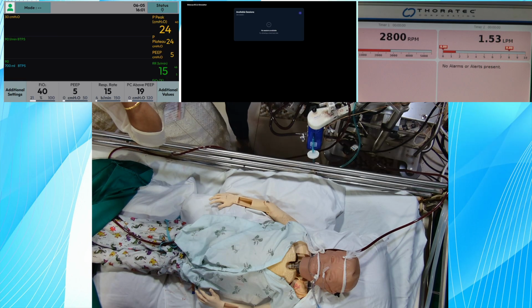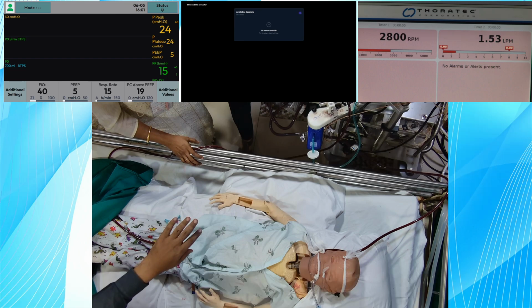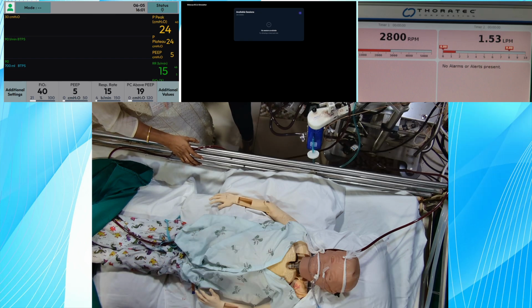In the cylinder, sir. So you want to keep the sweep gas at 15 liters? No, we'll make it less. We'll make it 8, and then we'll decide that. FiO2 100% at 15 liters for 15 seconds to decrease the membrane edema, and then we are coming down to 2 liters again.